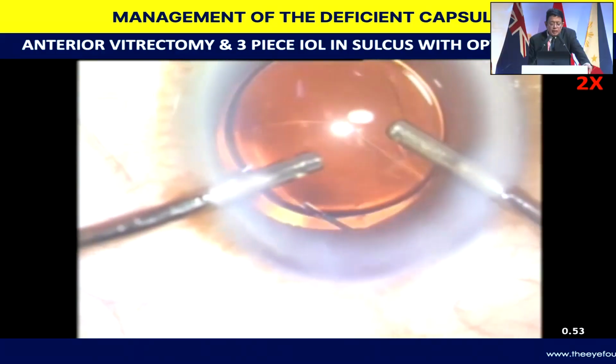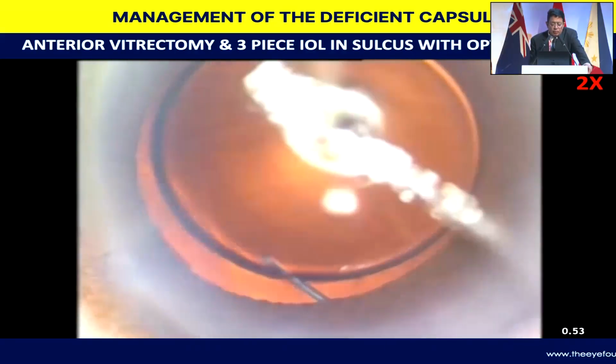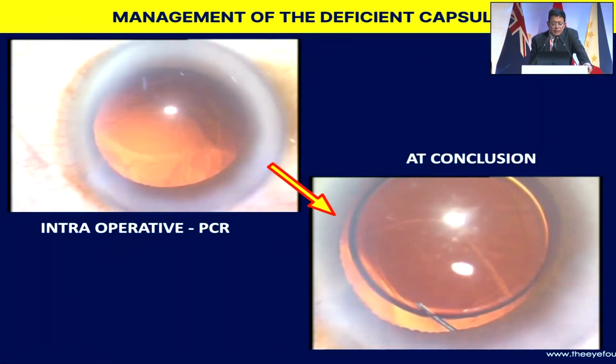It's essentially an optic capture that I'm doing. And whatever little strands of vitreous are there is again being taken care of. You can see the fairly large tear over there, but then that's the end of surgery. And this is what the patient had on the table, and this is what we ended up at the conclusion of the surgery. And mind you, this was done about 25 years back.